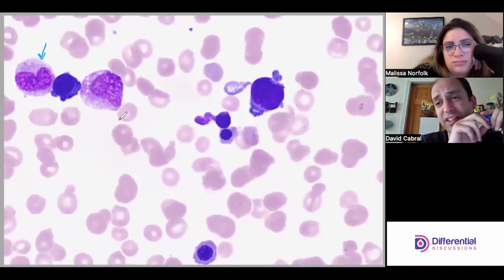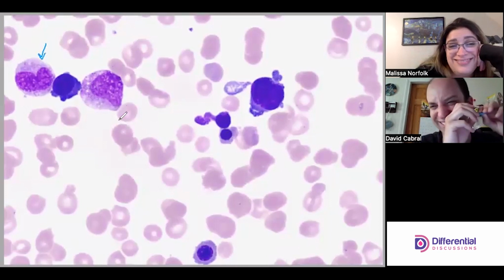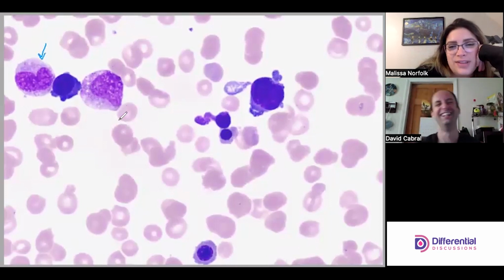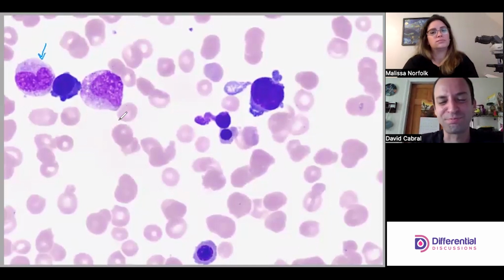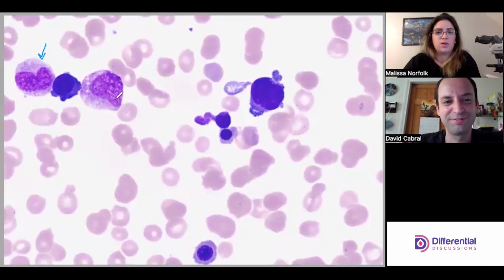This is trickier than the abnormal cells. I know. I'm gonna go with the mono. I'll defer. I'm gonna go with monos for both of them. This one looks mono-y, and this one, the nuclear chromatin matches this one. It's just those granules that are kind of weird for me. Yeah, a little weird. Funky.